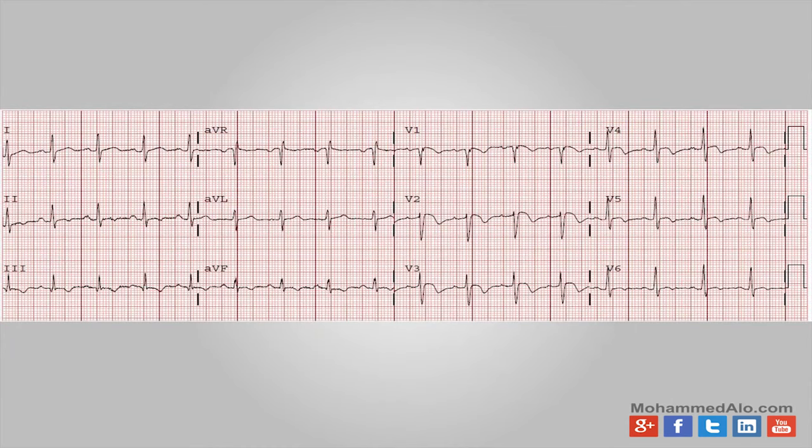Next EKG, you've got a funny looking pattern in V2 with the ST segment depressing into that inverted T. Sort of looks like Wellens' criteria. V4, you have an R wave, but it's not very tall. This could be an anterior MI. You should probably treat it as such. Keep getting EKGs and check troponins. This is sort of showing what Wellens' criteria looks like.